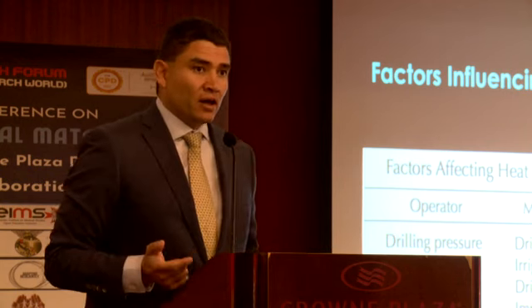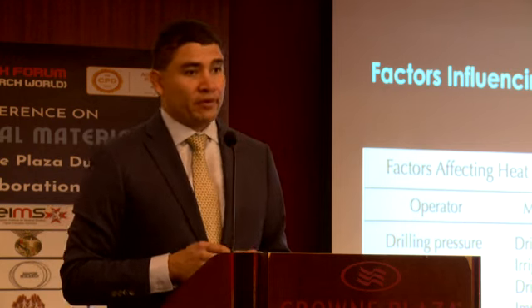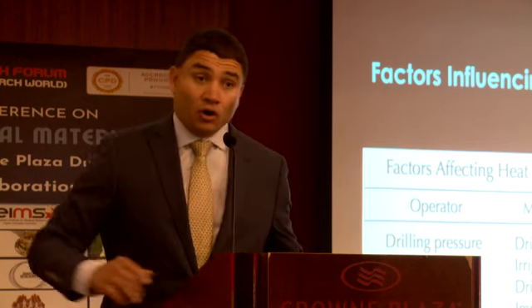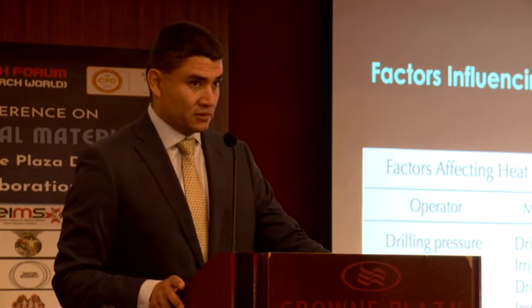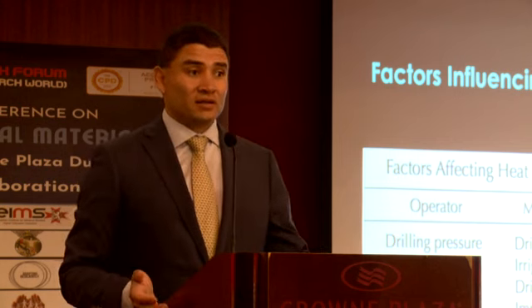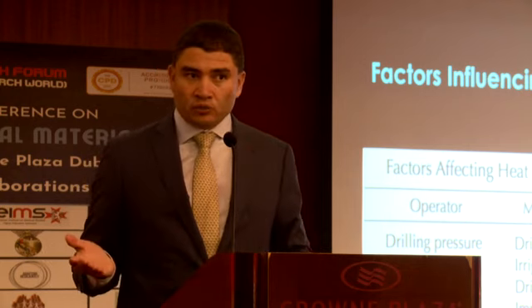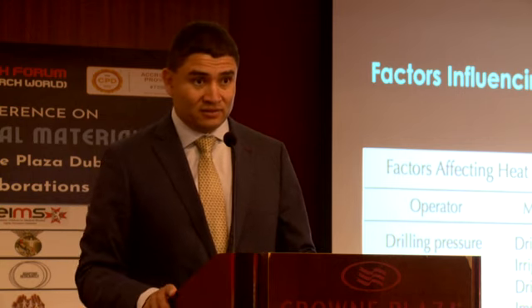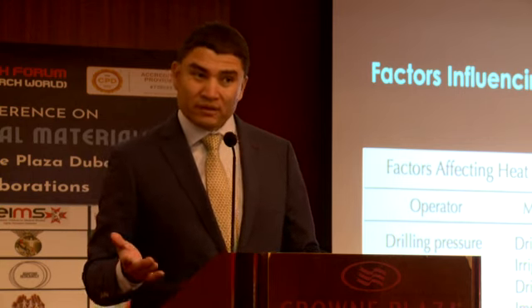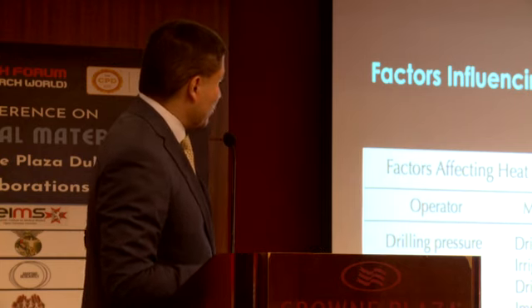The drilling speed: oh, doc, I was told that I should drill at 300 RPMs. Oh, you know, doc, actually, my manufacturer says that I should drill at 1200 RPMs. Which one is right? Why 300 and why not 1200? Why not 2000? Why not 35,000 the way we drill teeth? Does that matter? Well, it could. I'll show you.